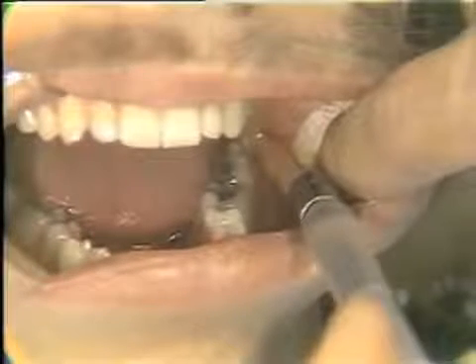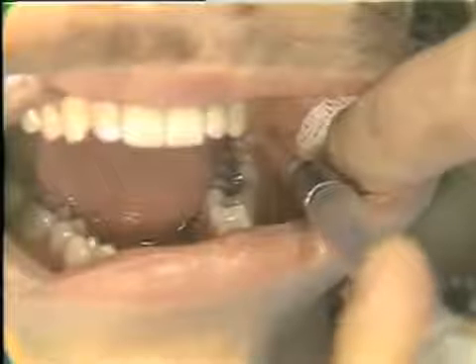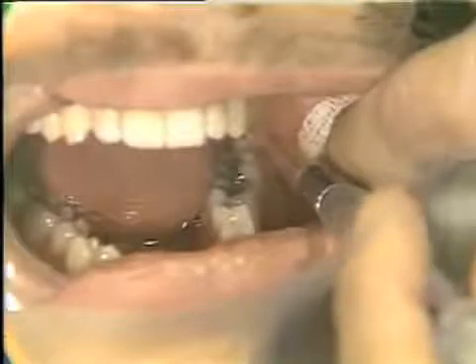Slight back pressure on the plunger. And then we're going to inject slowly approximately a cc of anesthetic, which will usually be adequate to anesthetize the long buccal nerve. All right, this we have accomplished, and now out quickly and let our patient close.